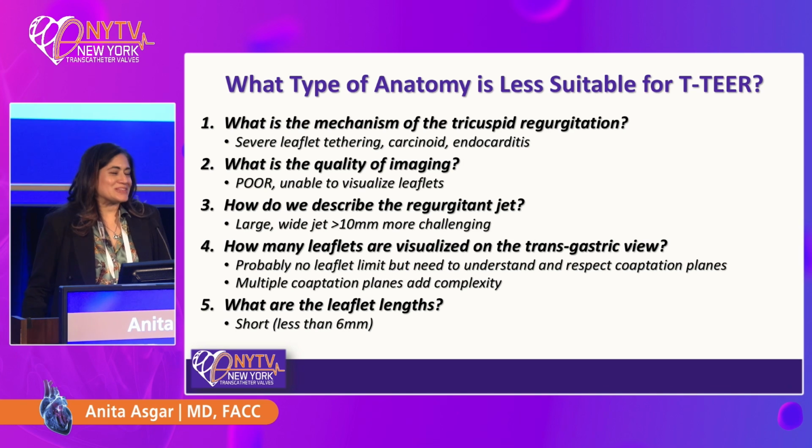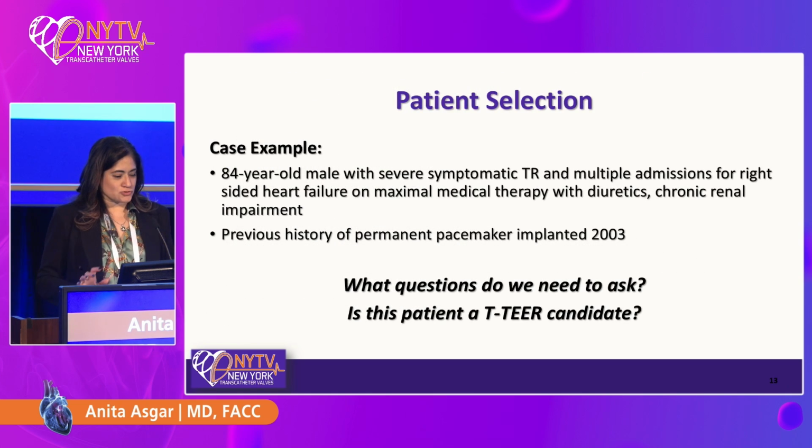And then what are the leaflet lengths? So obviously very, very short restricted leaflets are going to be difficult to clip. So I'm going to try to put these sorts of questions into a case for you and see if that can help you understand how we might approach a case depending on the types of questions.